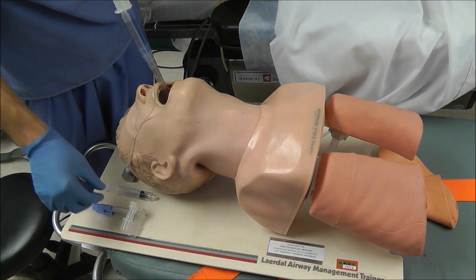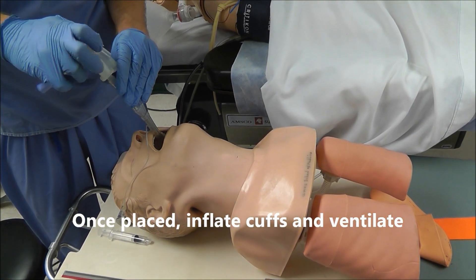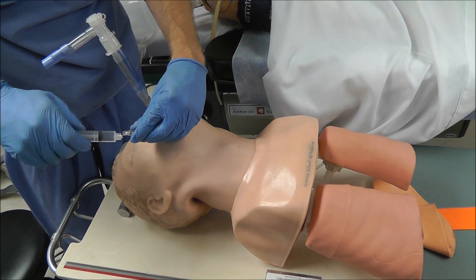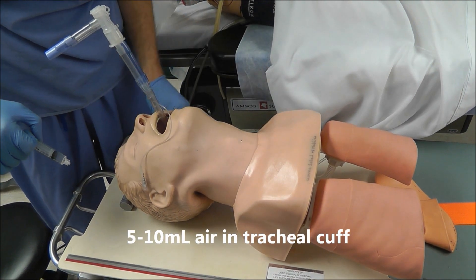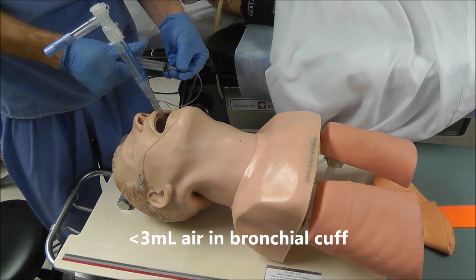Once this double lumen tube is in, we're going to need to ventilate the patient, so we need our adapter. We hook up the adapter, then we inflate our cuffs. We put some air in the tracheal cuff, and then some air in the bronchial cuff — you really only want to put two to three cc's of air in the bronchial cuff.